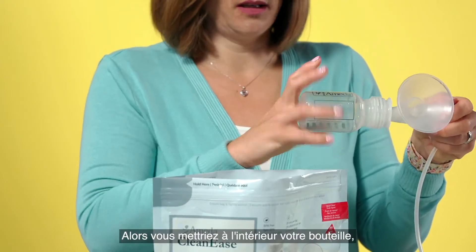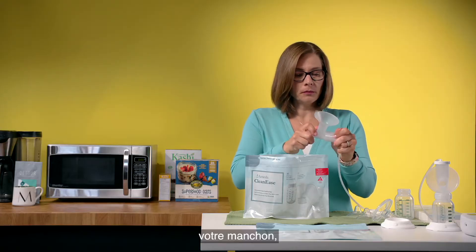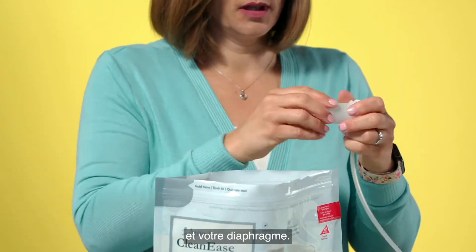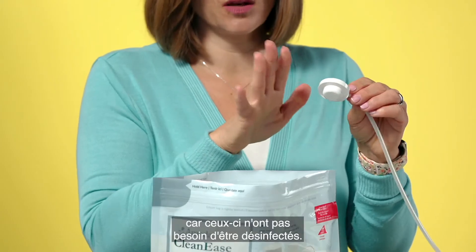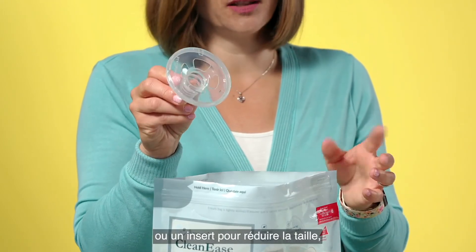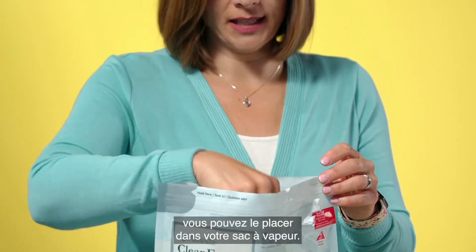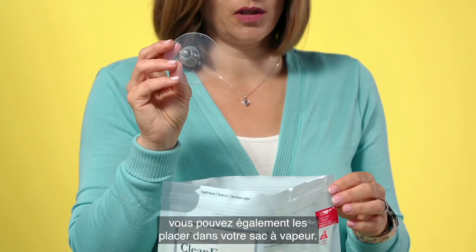So you would put in your bottle, your valve, your flange, and your diaphragm. There's no need to put in your tubing or your adapter cap because those don't need to be sanitized. If you happen to be using a flexi shield with your pump or an insert to reduce the size, you can place that in your steam bag, and if you're using any nipple shields you can also place those in your steam bag.